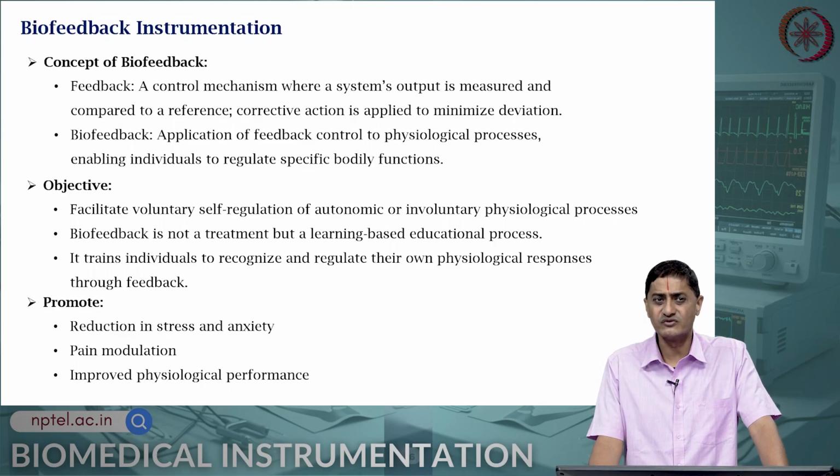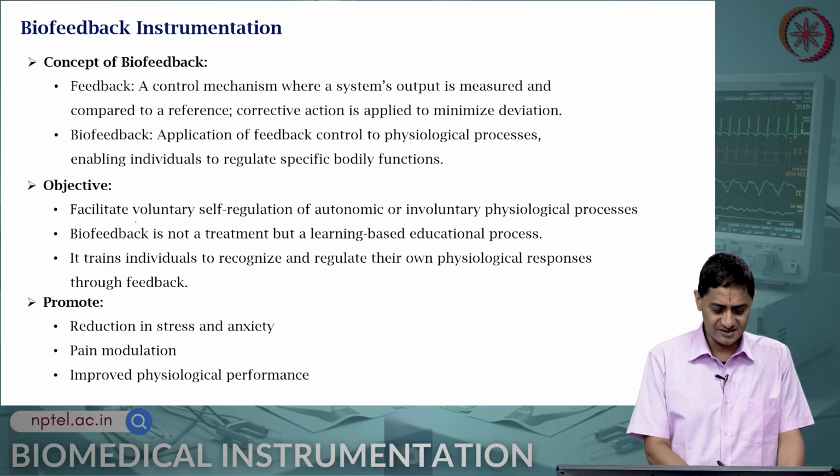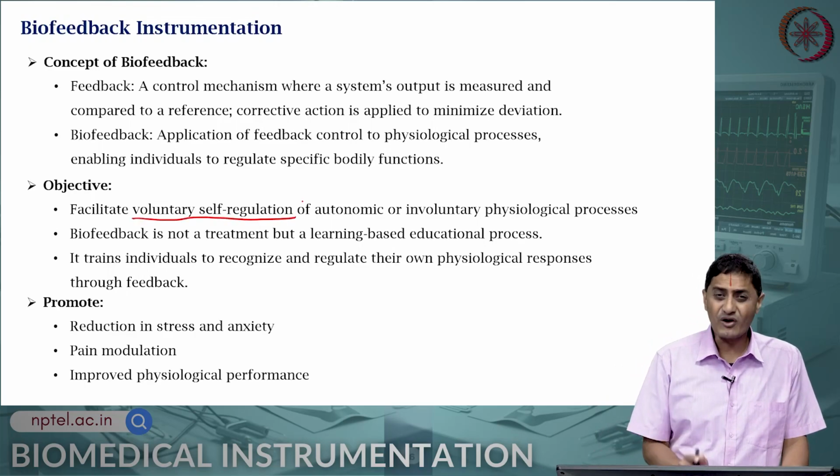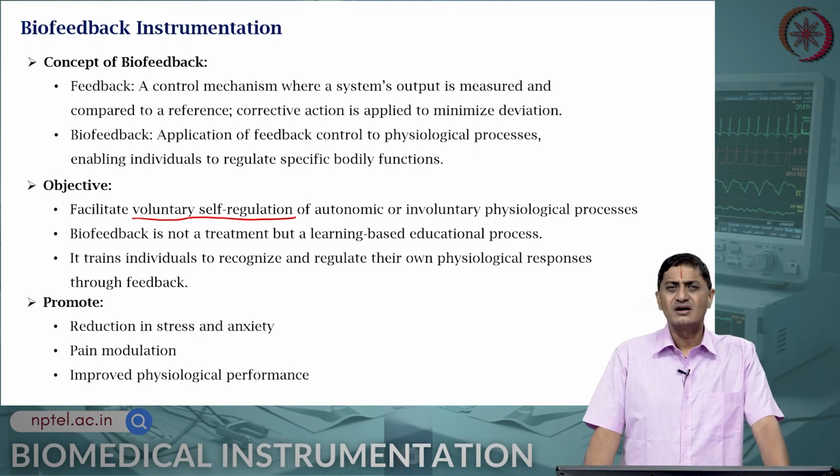Sometimes it is also used for learning. So, this is not really treatment in the technical sense of the word. It is not exactly treatment, but rather a form of learning, voluntary self regulation. Essentially this will facilitate voluntary self regulation of autonomic or involuntary physiological processes.